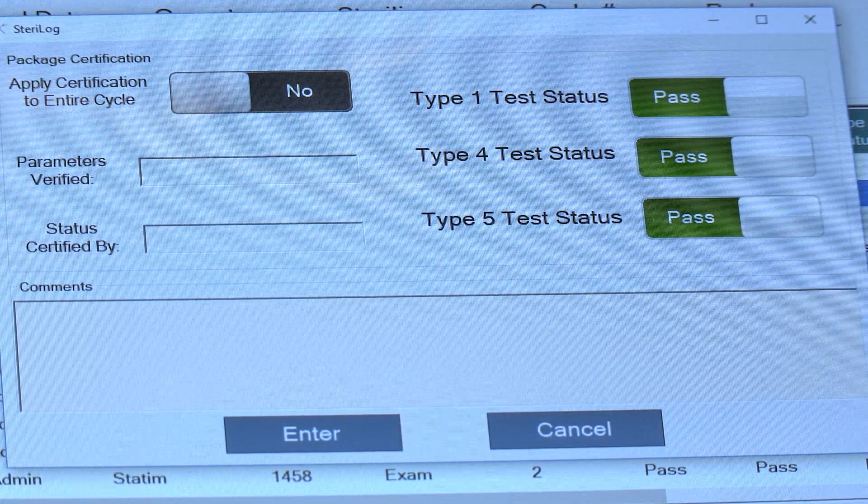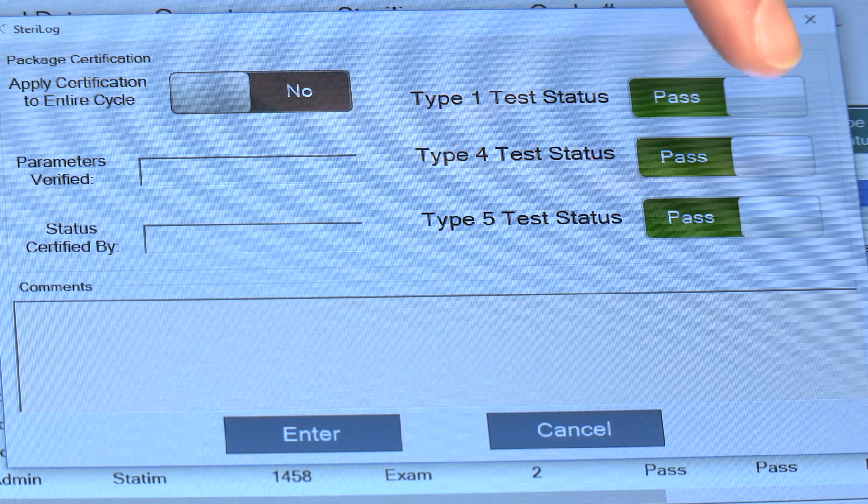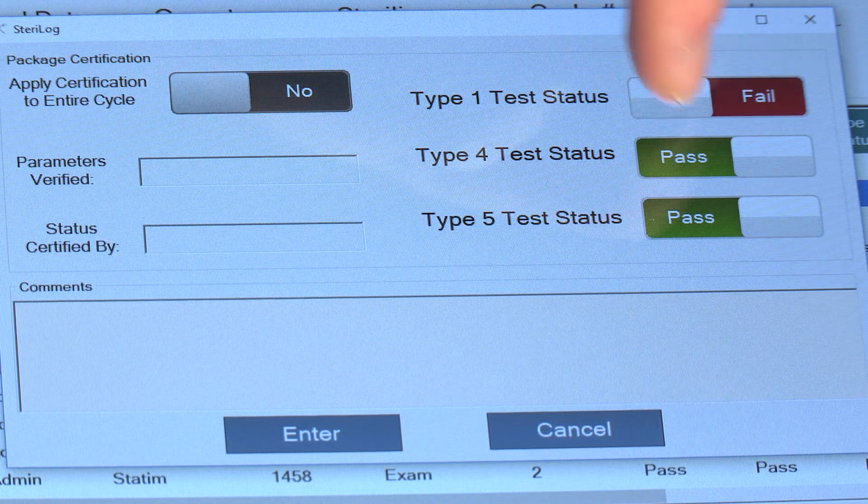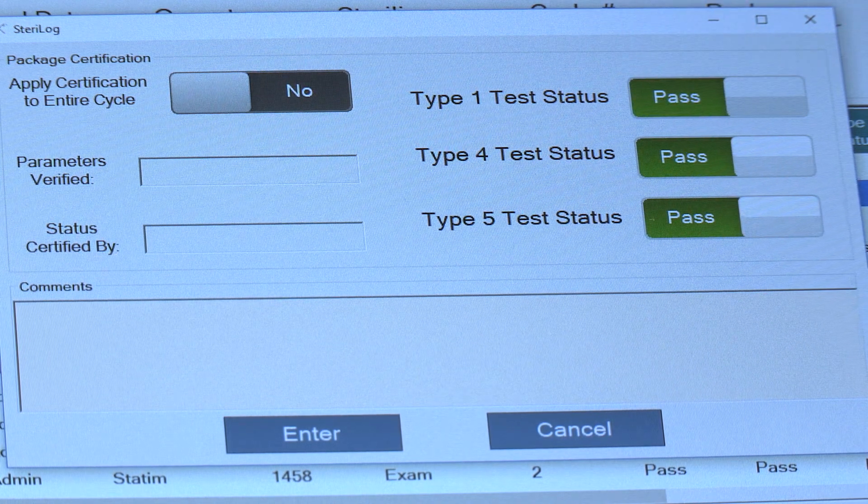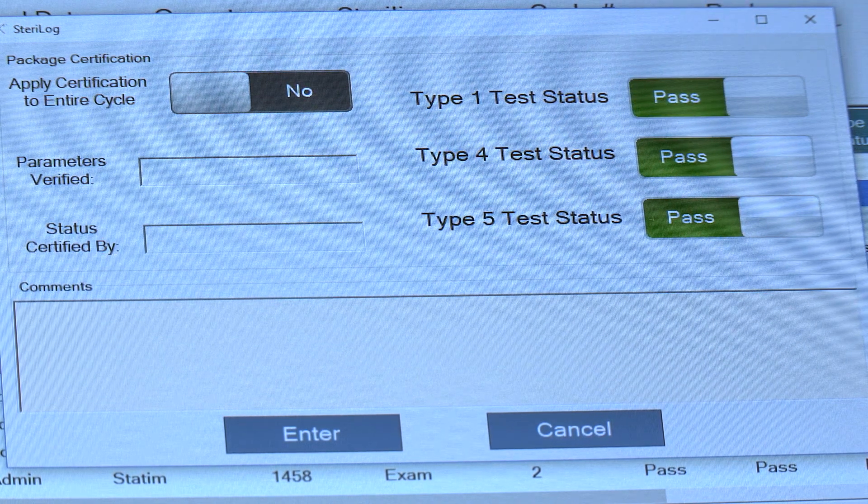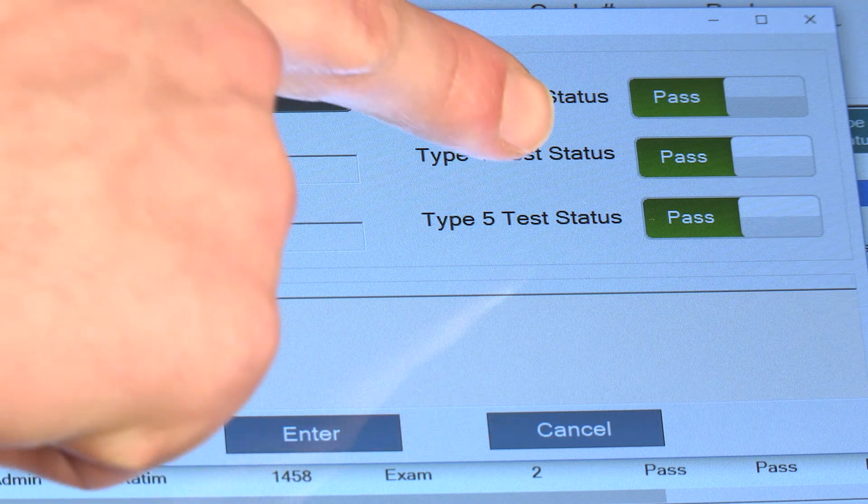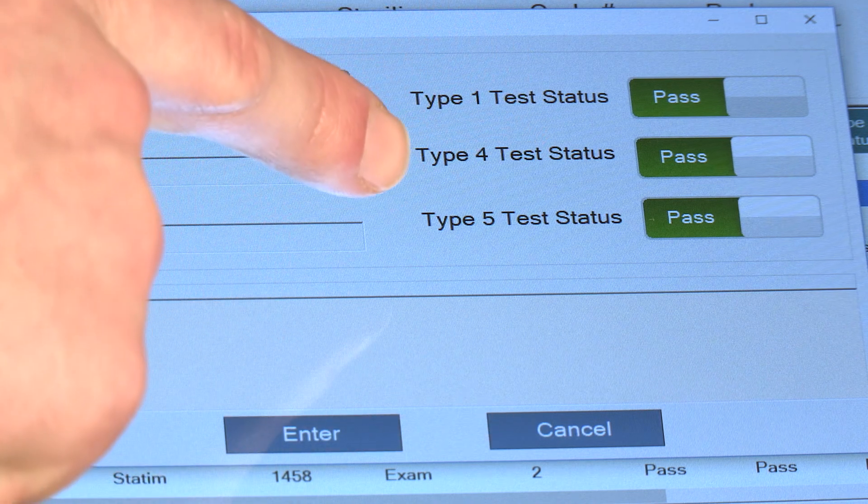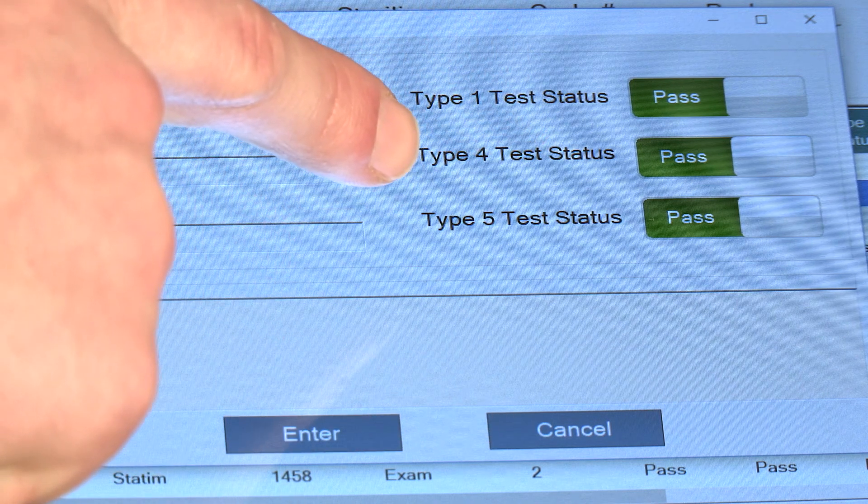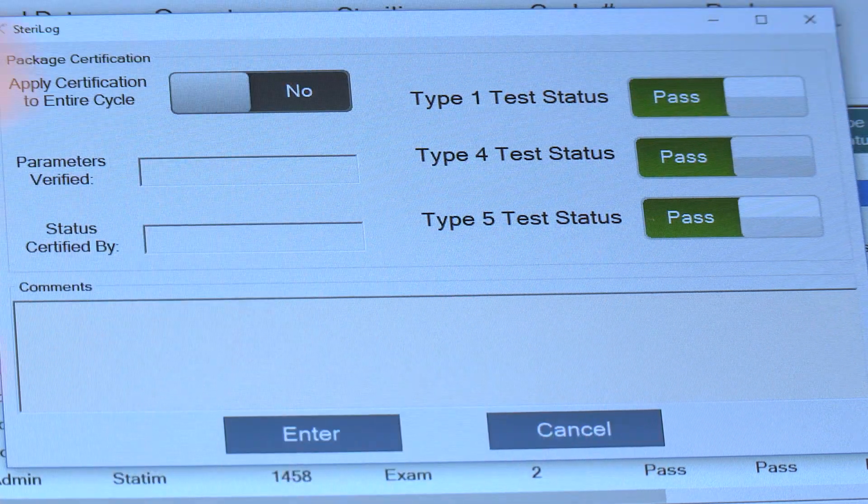Over here you have your chemical indicator results. Each one of them has a toggle switch representing whether or not the test was passed. So in the event that the Type 1, 4, and 5 tests were all passed, you select them and set them all to Pass.